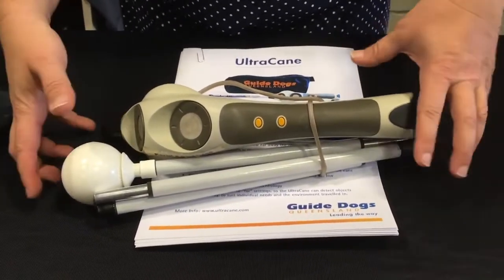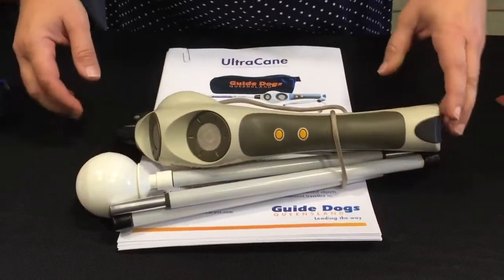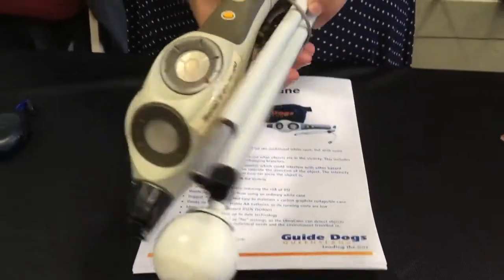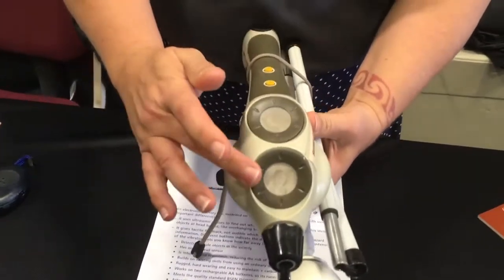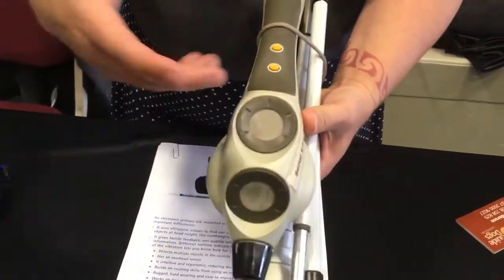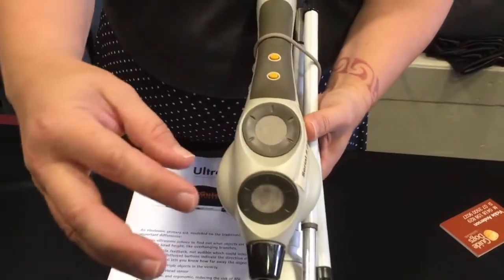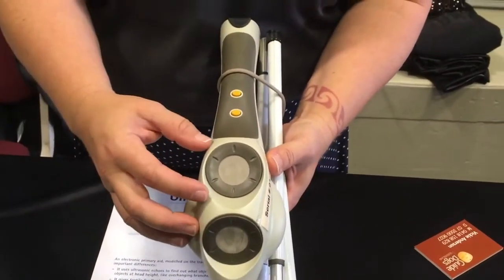The Ultra Cane is a sonar cane — it actually has two sonar sensors. It's kind of like a bat cane: it sends out a signal and then it bounces right back to the device.